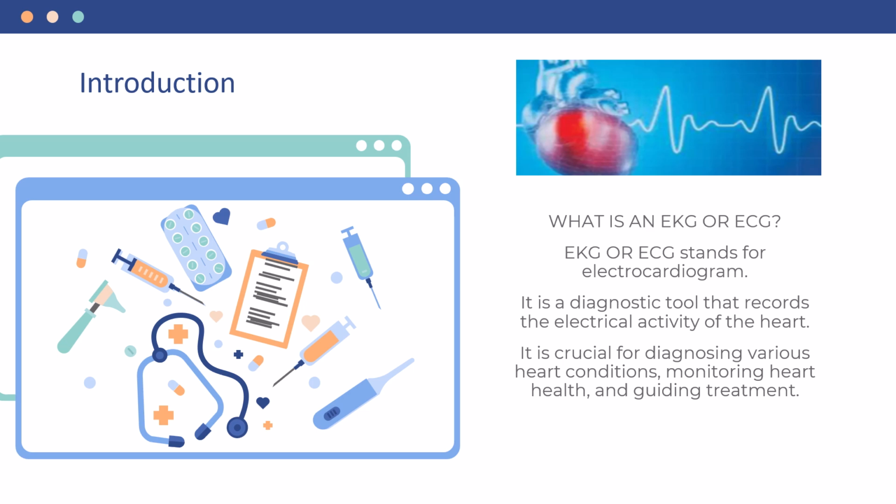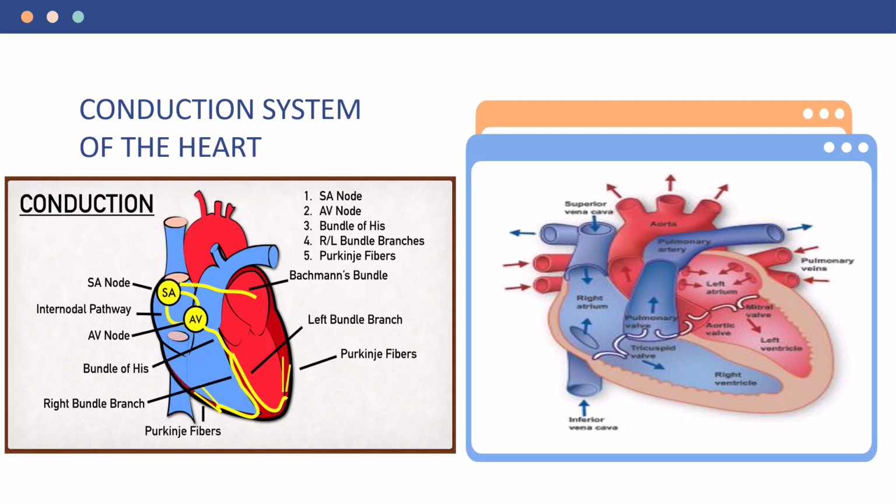What is an ECG or EKG? It is a diagnostic tool that records the electrical activity of the heart. It is crucial for diagnosing various heart conditions, monitoring the heart health, and guiding the treatment. It is a tool, but it is not a diagnosis in itself. I repeat again, okay? It stands for electrocardiogram.